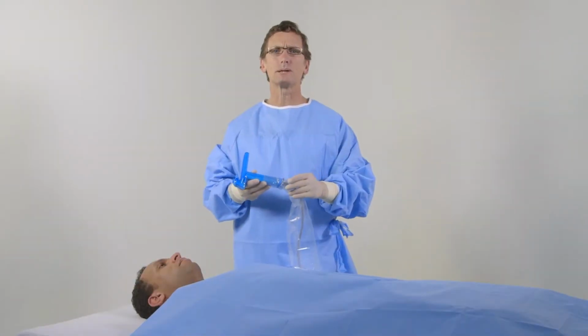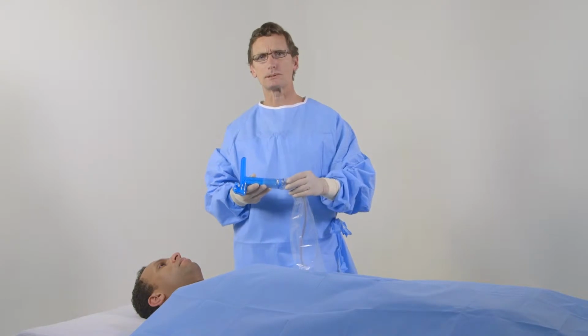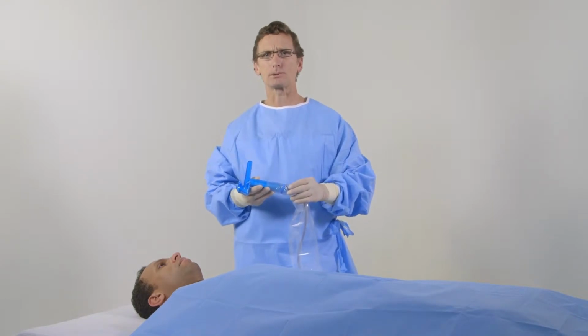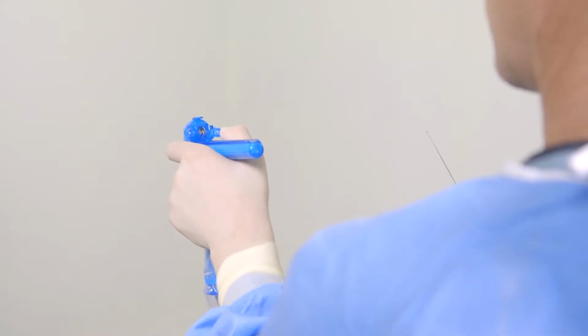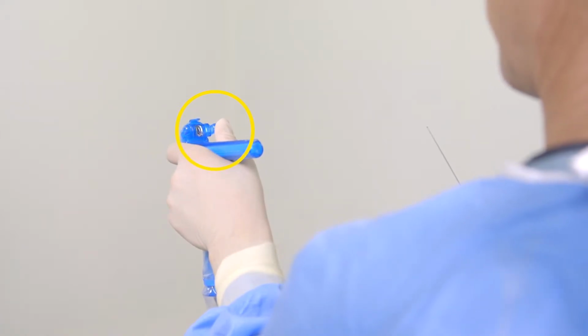To begin a procedure, assemble the transducer and sterile shield from the AxoTrack 1 procedure kit and preload the needle into the integral needle guide. Start preloading the needle by rotating the needle clamp fully forward with your thumb to the open position, such that the needle guide opening is unobstructed.